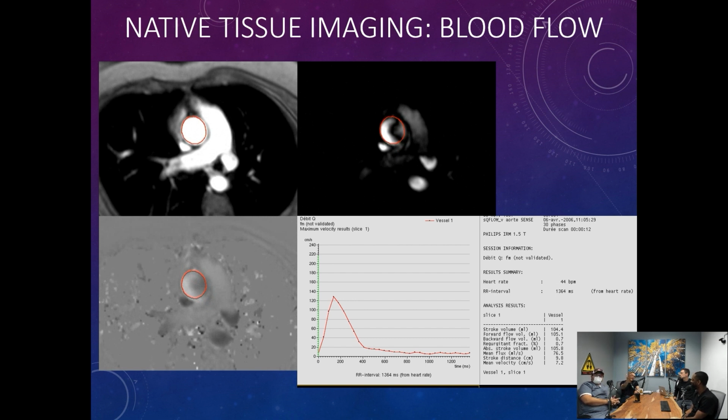For sure. What we have here is we're better than ultrasound, in my experience, to measure flow. We're perhaps not as good to measure peak velocity because we're not necessarily at the area that's the narrowest, where the velocity accelerates the most, called the vena contracta. That's the technical term for that. So it's certainly a useful thing that we can use for flow quantitation.